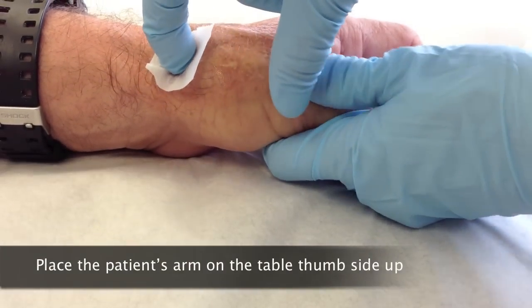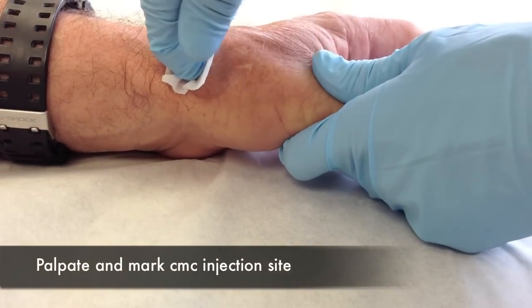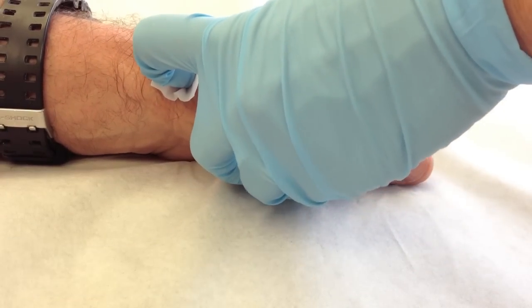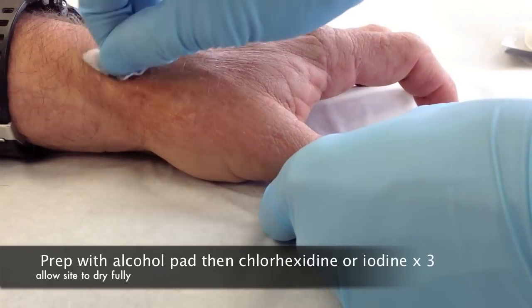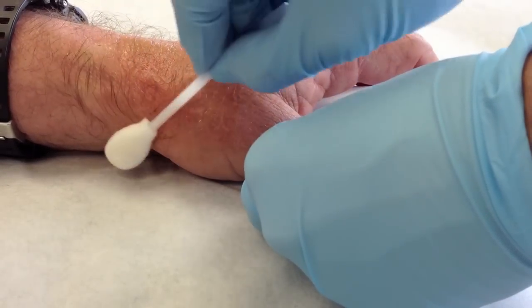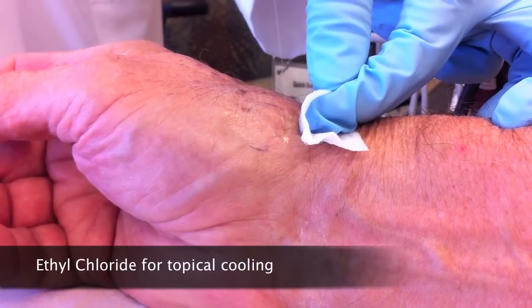For the thumb CMC joint injection technique, place the patient's hand on the table, thumb side up. Moving the thumb can help you feel the articulation better. Palpate the CMC joint and mark the injection site with a pen cap or nail — you can see the marked site on this patient. Prep the site with an alcohol pad and then chlorhexidine or iodine times three, and allow the site to dry fully.